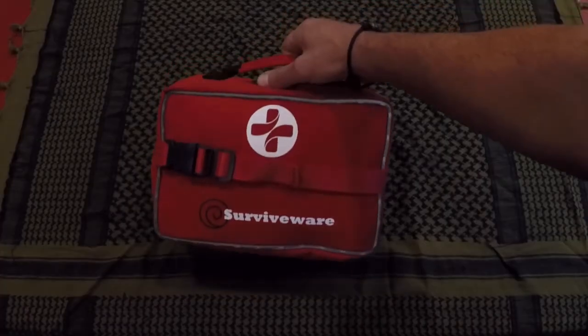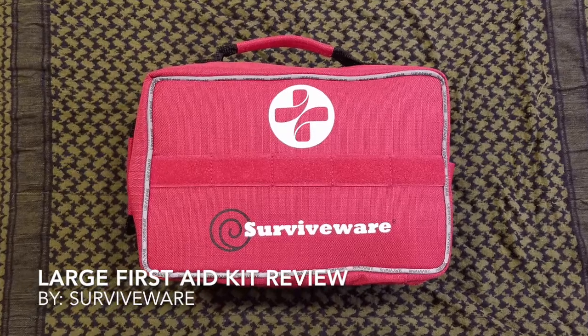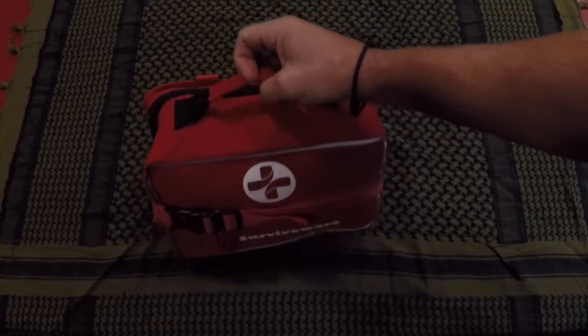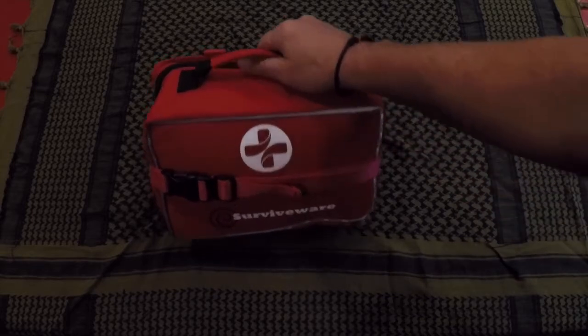Hello, it's Helder here. Today I want to talk to you about this large first aid kit brought to you by a company called Surviveware. I have a smaller version — actually the first first aid kit that Surviveware put out — and it's been part of my gear ever since I reviewed it.